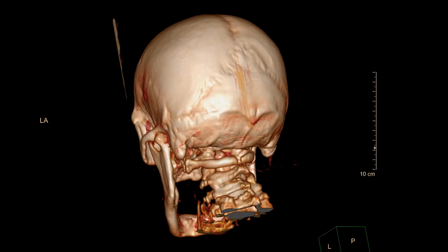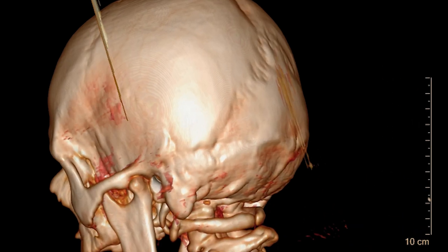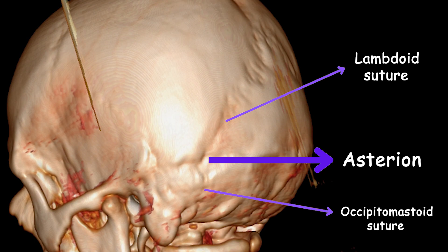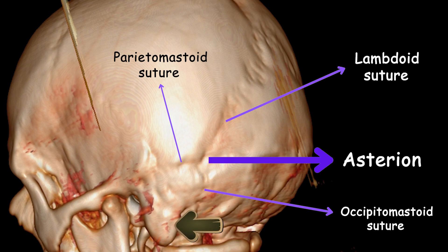There is a specific anatomical point on the lateral side of the skull called the asterion, which is visible in this image. It is located at the intersection of three sutures: the lambdoid suture, the occipitomastoid suture, and the parietomastoid suture. The asterion is formed by the meeting point of the lambdoid suture, which separates the occipital bone from the parietal bones, and the occipitomastoid and parietomastoid sutures, which separate the occipital and temporal bones from the parietal bone, respectively. The asterion is positioned just above the mastoid process, a prominent bony projection on the temporal bone behind the ear.